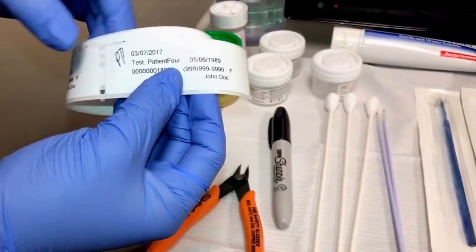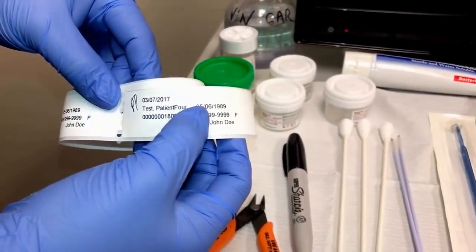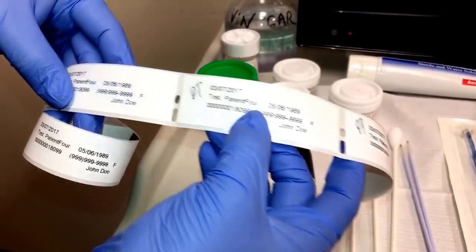With these labels it has the patient's initials, which confirm their first name, last name, and date of birth, and you want to be sure that the patient does label every single one.